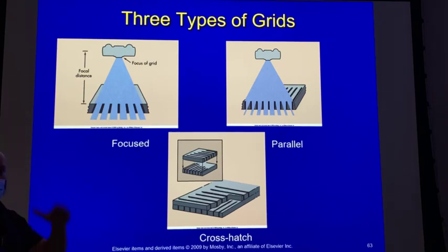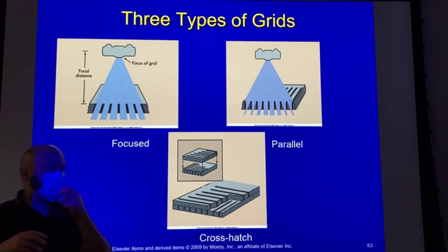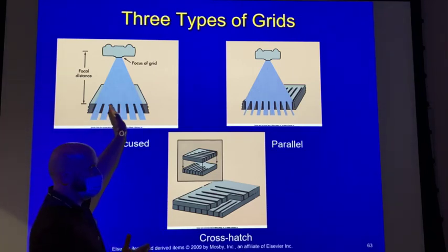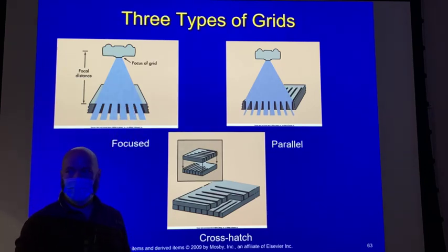So you're going to have grid cutoff if your focus is exceeded in either direction. If you come in too close, if your SID is too close, if your grid focus is 48 to 80 inches and you use an SID that is 30 inches, then your divergent central ray is too broad for your canted grid strips. Does that make sense? You're going to have grid cutoff.